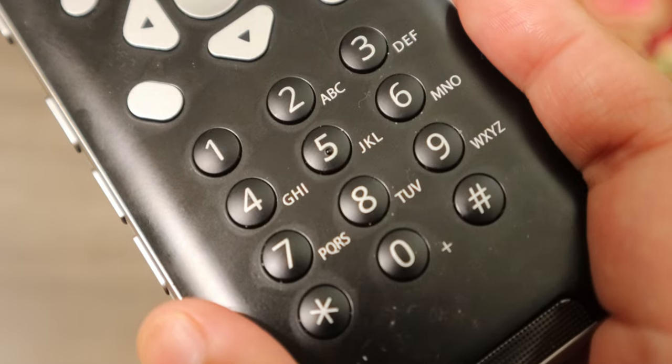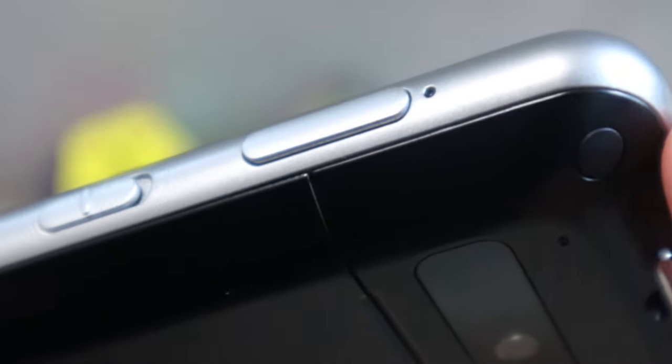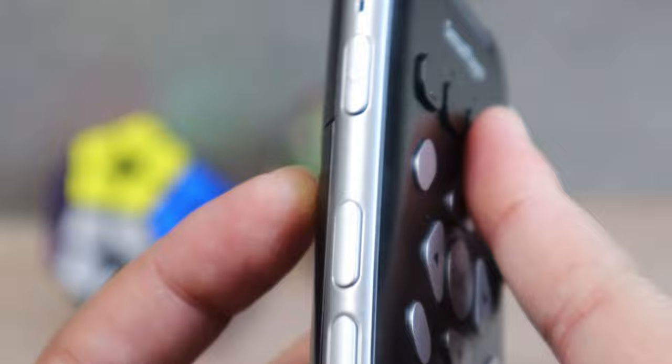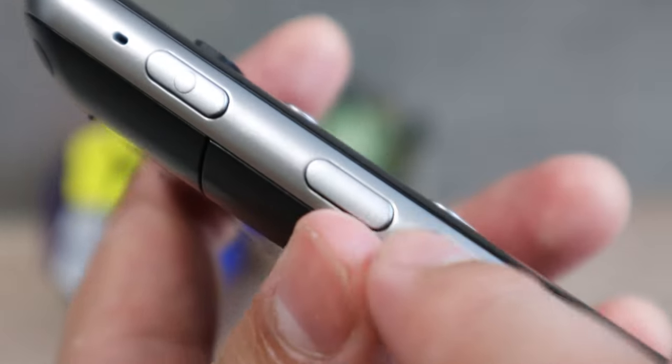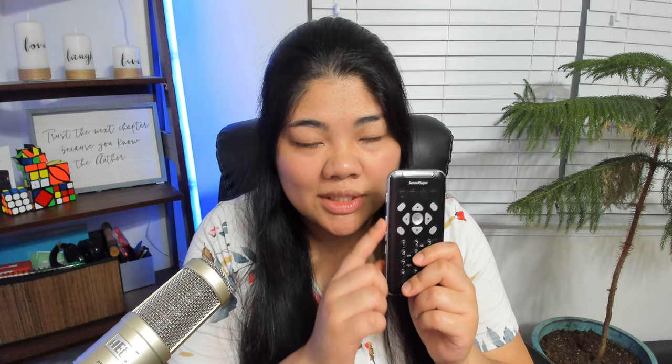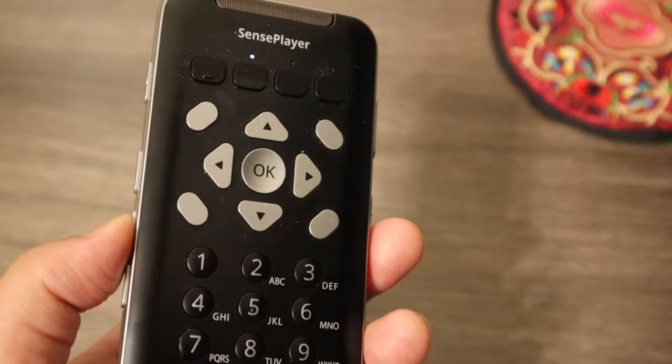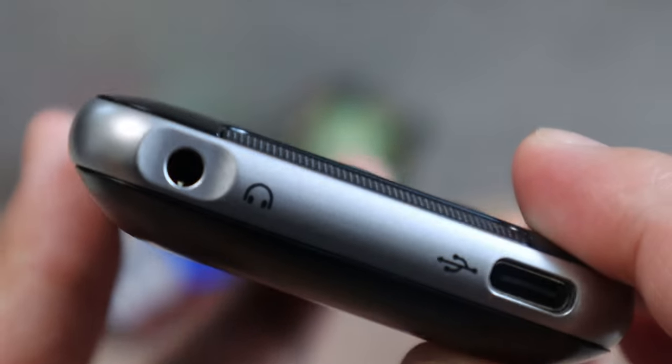The bottom section is your group of T9 buttons: one through nine, star, zero, and pound. On the right edge you have the power button and below that is the lock slide switch. On the left edge you have the record button and then what HIMSS calls the voice control button — this button cycles you through volume, pitch, equalizer, and different settings depending on what app you're in — and below that are the volume keys. For example, if you keep pressing the voice control button and go to pitch, you can use the volume keys to adjust the pitch. Right below the volume buttons on the left edge is the microSD card slot. On the bottom edge you have the headphone jack on the left and the USB-C port on the right.